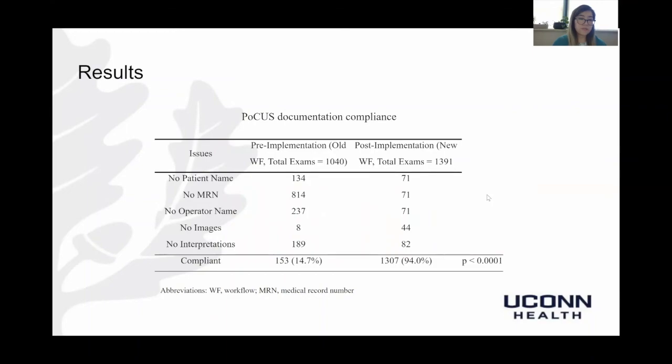We measured areas of non-compliance for both workflows, as well as exams that were fully compliant in documentation. Compliance was defined as the inclusion of the patient's first and last name, medical record number, name of the operator performing the ultrasound, acquisition of POCUS images, and documentation of an interpretation. There was a statistically significant increase in the number of exams that were performed in compliance after implementation of the new workflow compared to the old workflow.